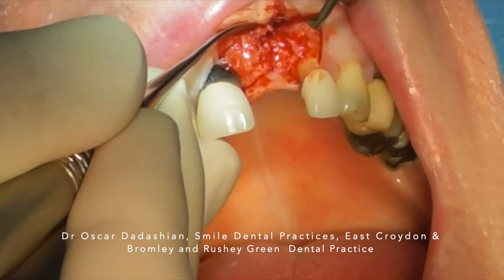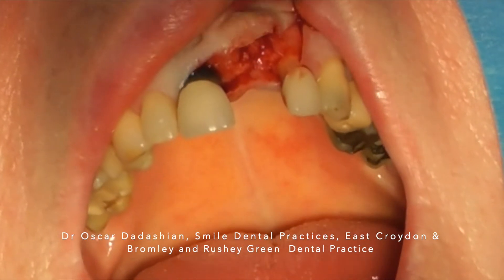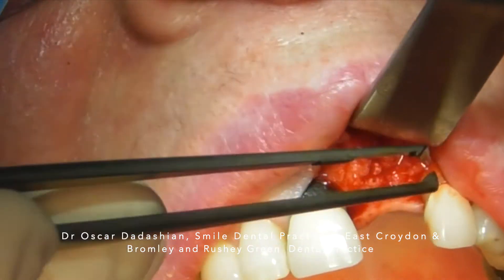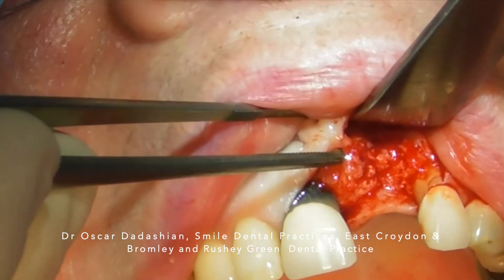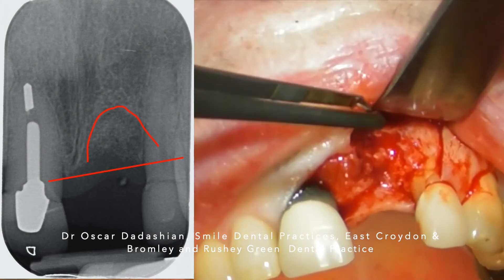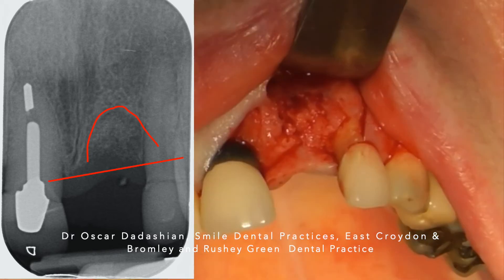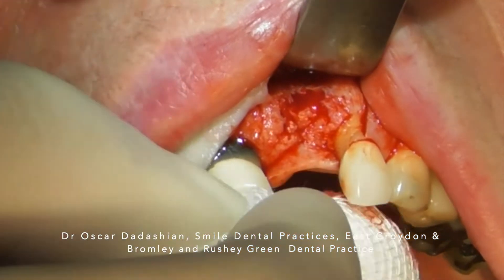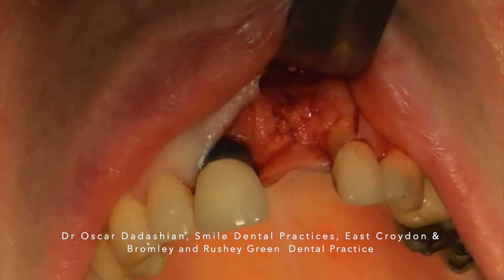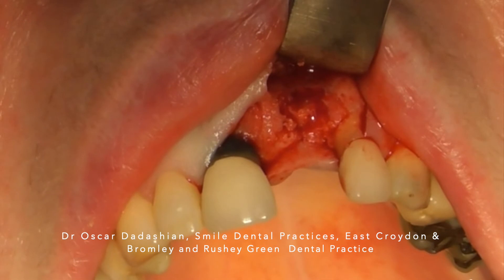As predicted, this is definitely a socket type 2b — you can see the margins and the bony peaks. The bone grafting material has integrated with the bone but is not yet fully mature. You can see the bony peak distally has been repaired and you can see the extent of the bone grafting material. The most remarkable part here is the bleeding — that tissue has lots of blood vessels in it, and you can see as soon as we dry it up it starts bleeding again.